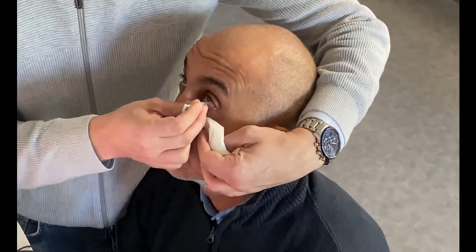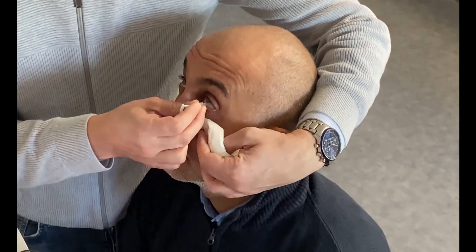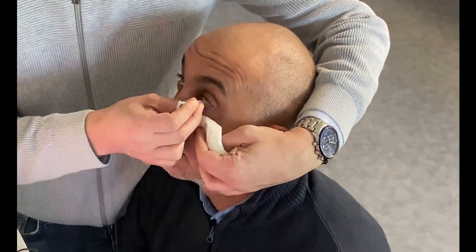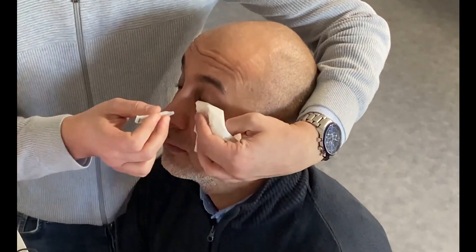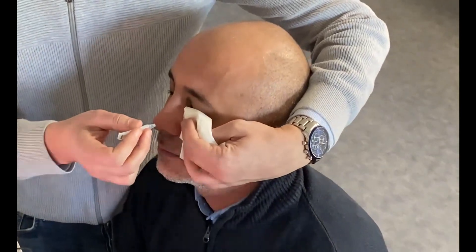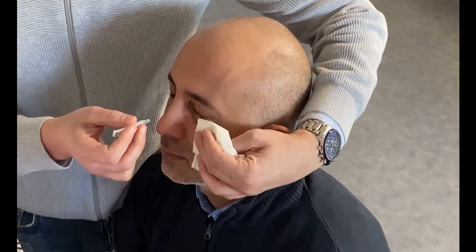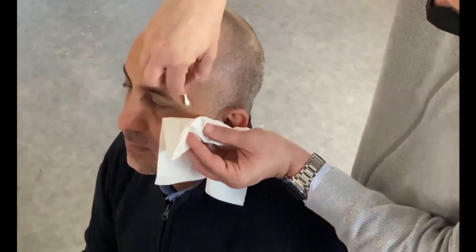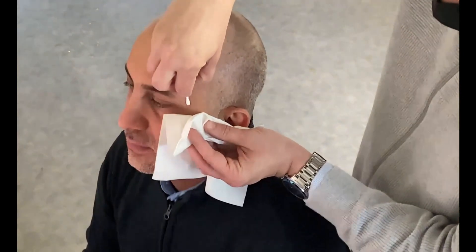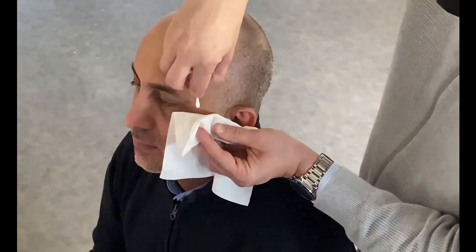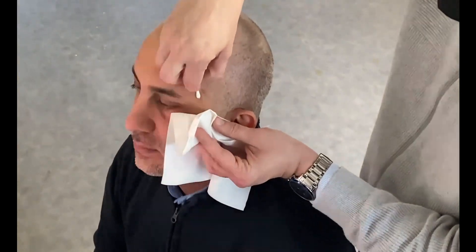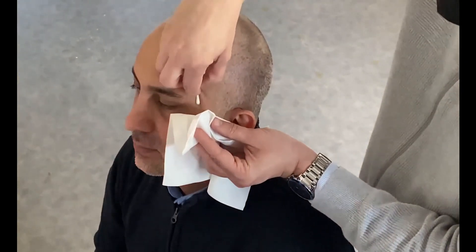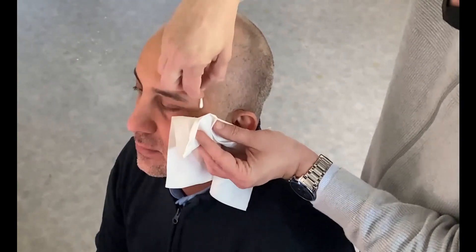Now we will put drops to dilate the pupils and drops for local anesthesia. Skin electrodes will be placed close to the canthi and the skin preparation is very important.